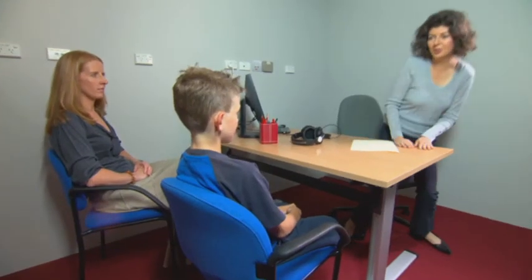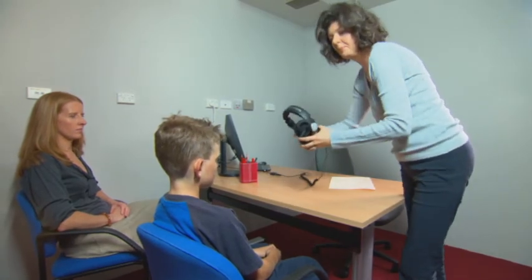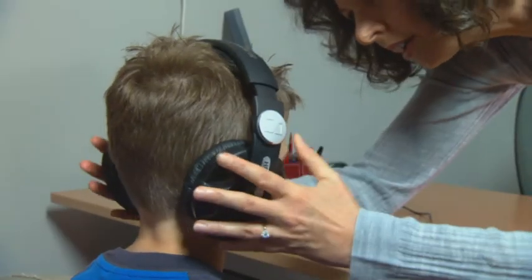Once you've heard the sentence, tell me what you've heard straight away so you don't forget it. In the first lot of sentences, the tricky people will be standing right next to you. Don't listen to them. Just concentrate on Miss Smith in front. The tricky people start first and then Miss Smith starts a few seconds later. Ready? Yep. I'm just going to put these headphones on you.